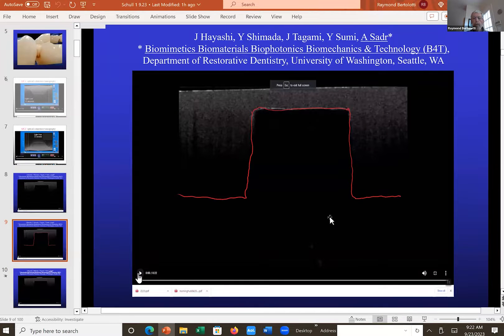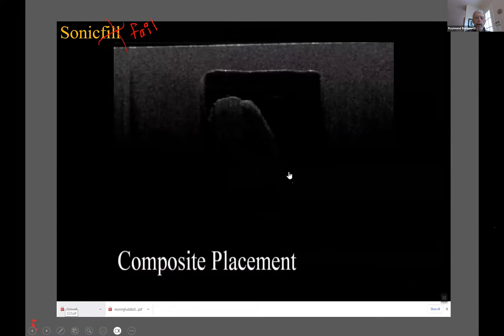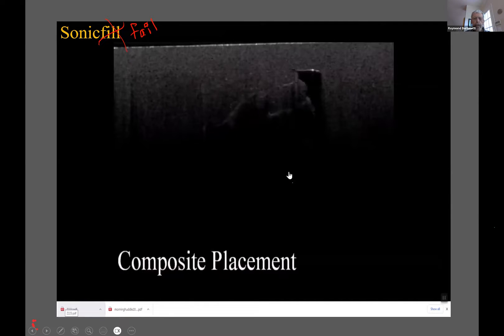So what you do, you put composite in there. And here's one in a prep. Now here's Sonic Fail — that's my nickname for it. Let's go ahead and put it in and watch it fail. There goes Sonic Fail in there. Now, it's in there pretty nicely. I don't see any problems.